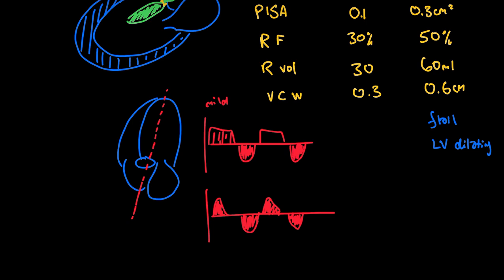There's two things that we can gather from this. One, I've tried to show a light shading with the mild versus the severe. I've tried to shade that in more, and basically the brighter the trace looks, that corresponds to more blood cells that are involved. So if this regurgitant flow is very bright, that means there's a lot of red blood cells leaking back. That suggests severe regurgitation.